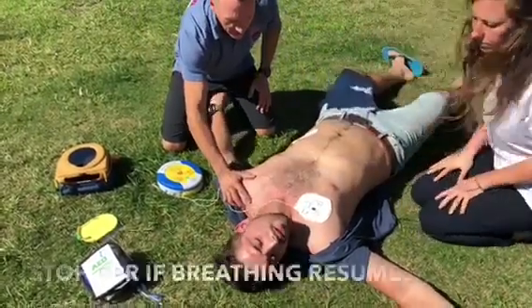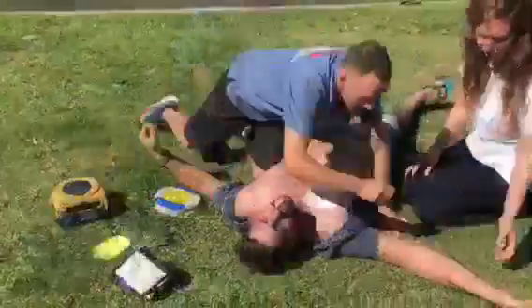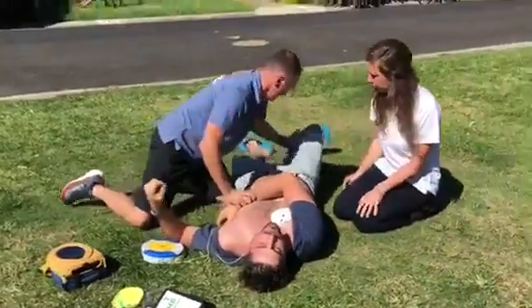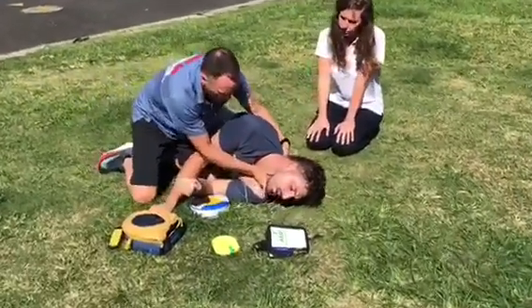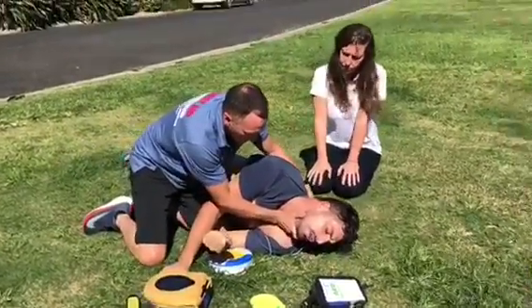If you get signs of life, stop CPR, check breathing, and place the patient into a recovery position. Monitor their airways and breathing until medical assistance arrives.